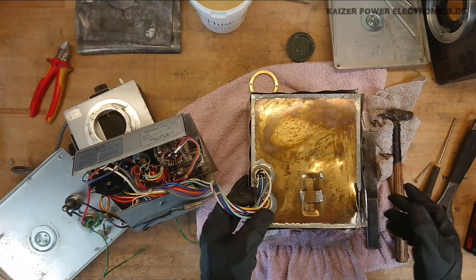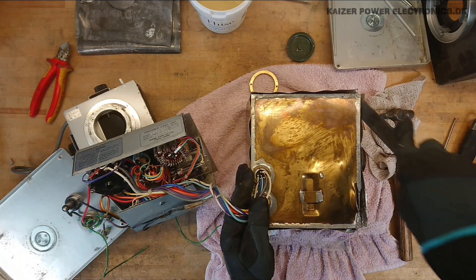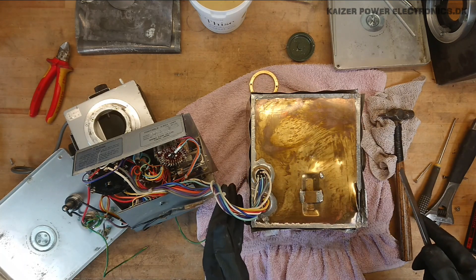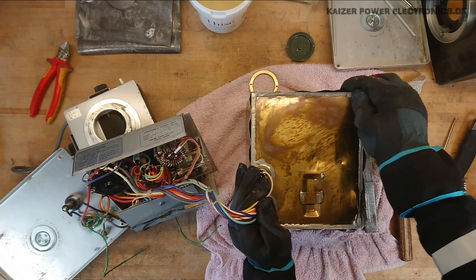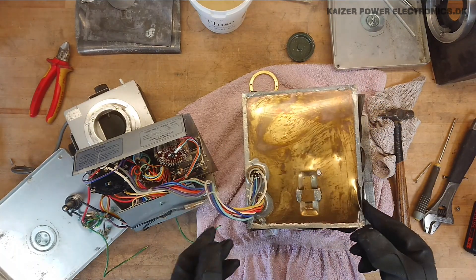That went extremely much faster than expected — absolutely no problem just hammering it open. Once you just get into the seam, then it's very easy to open it, just like a canned piece of food. So let's see how this comes off. There.